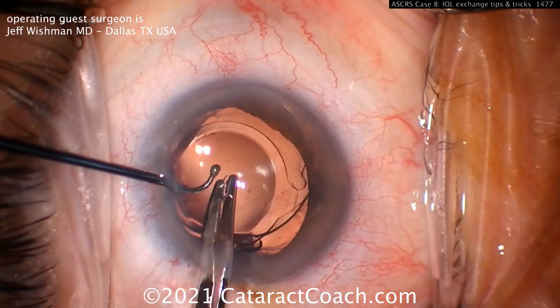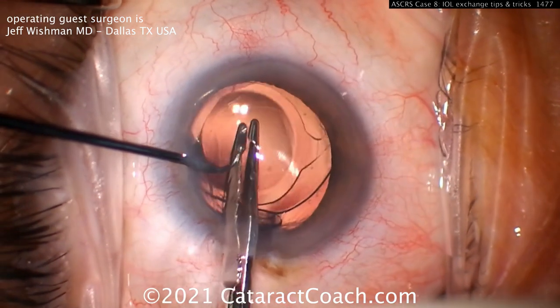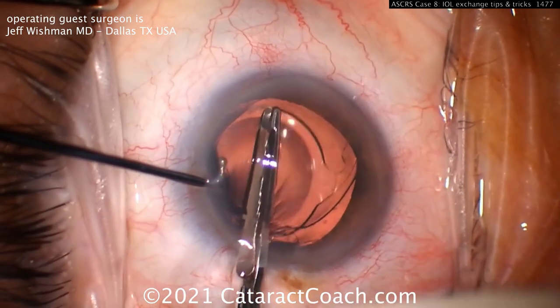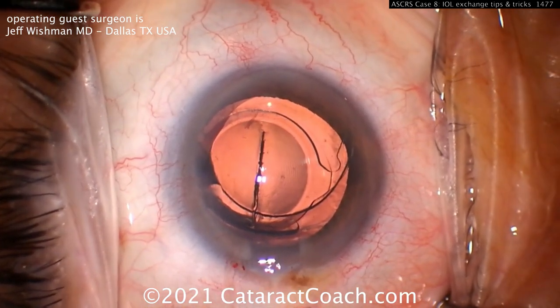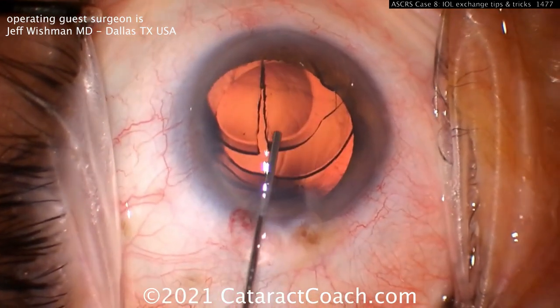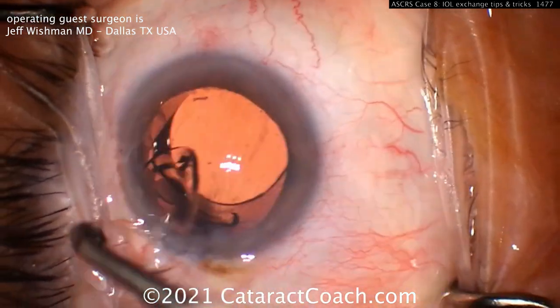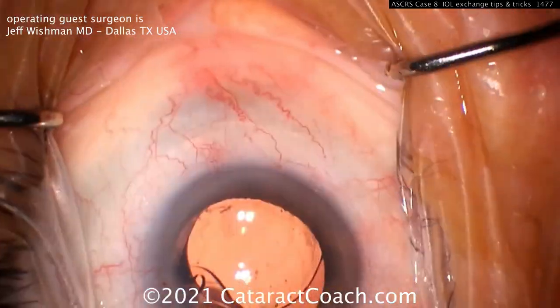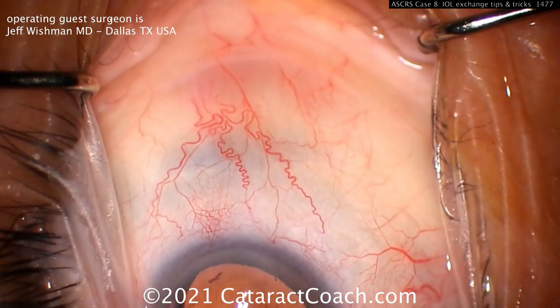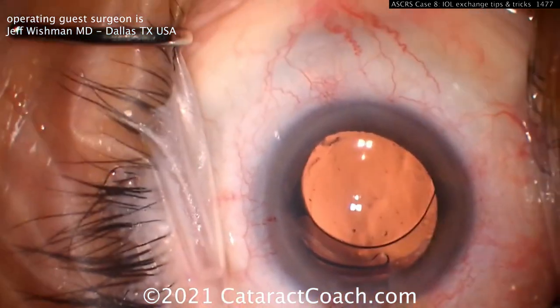You can cut all the way through to create two distinct halves, or cut mostly through so the two halves remain connected — that actually makes removal easier. With a full cut, viscoelastic is your friend to give working room; pull out one half, and the other half is still slightly attached at the very end, which facilitates removal. Smart pearl: don't cut all the way through the optic — leave it a little attached to make your life easier. These are your options for performing an IOL exchange.